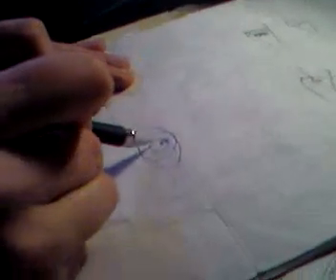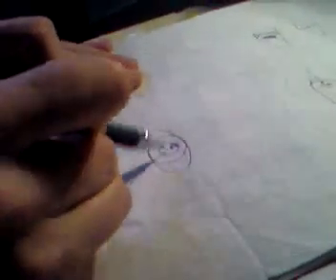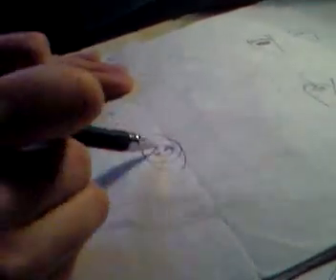I conclude that his vitreous and lens are transparent because the reflex is equal everywhere. If there is opacity, in front of the red fundus reflex there will be shadows of black color. These shadows may differ in shape and localization, but in front of the red you will have black shadows. You must decide where they localize.